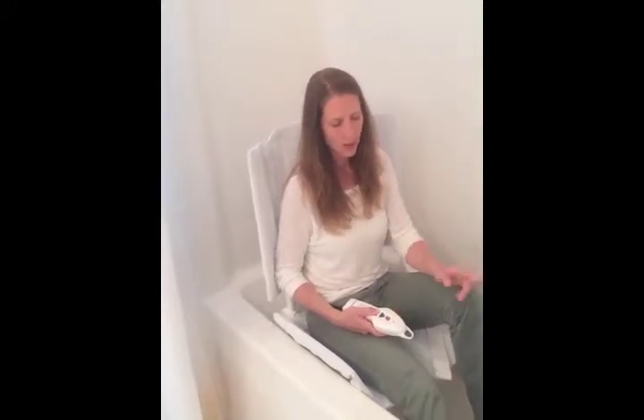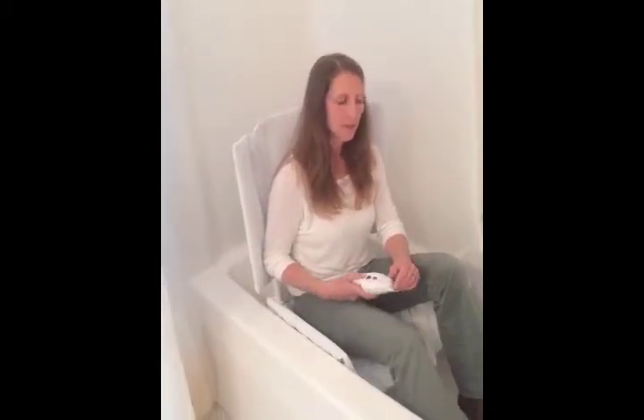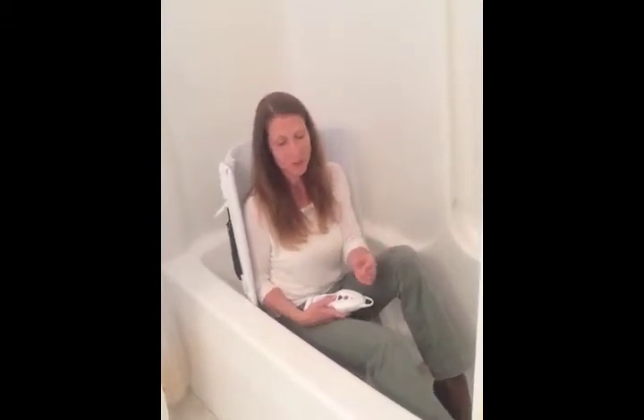Now, one of the negative parts of this bath lift that people really don't like is it's kind of heavy — it's 26 pounds. So if you've got more than one person using the bathtub and not everybody uses the bath lift, it's a bit of a hassle to take it in and out every time. I've had people who are unhappy because it's heavy and they don't want to take it in and out — that's one big negative I've heard.